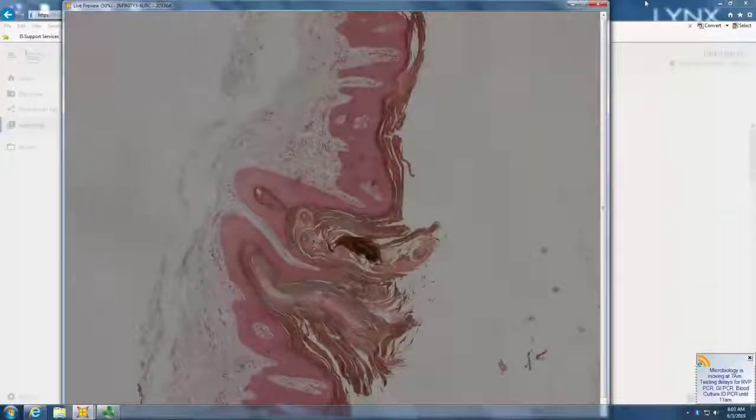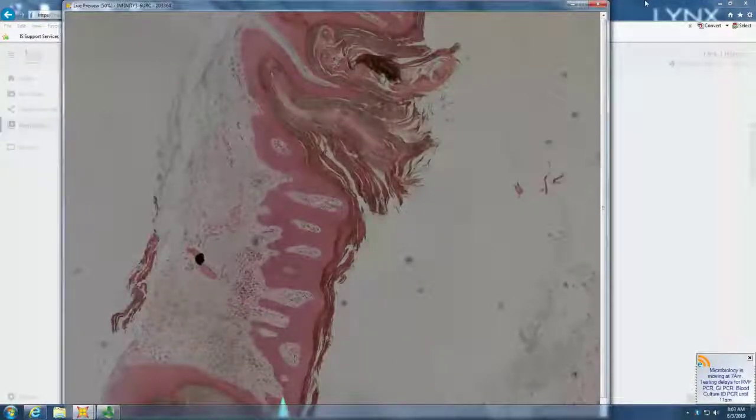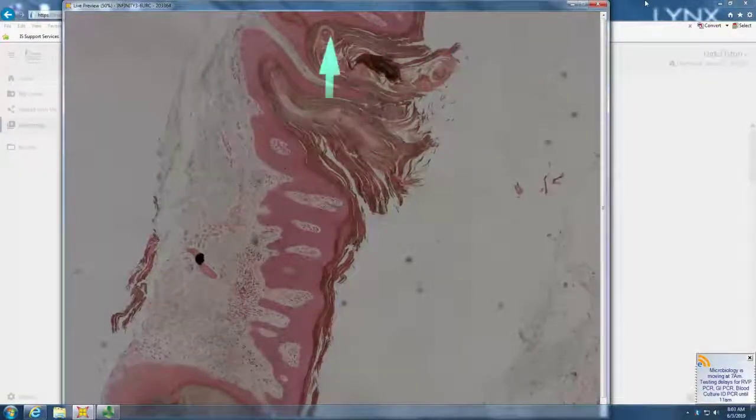So there's acanthosis, hyperkeratosis, alternating. Are the suprapapillary plates thin, like psoriasis, or are they normal? They're normal. So hyperkeratosis, sort of a psoriasiform hyperplasia, but the suprapapillary plates are not thinned. Where do you have more hyperkeratosis? Oh, the hair follicles. So clinically, these would be follicular spines, right?